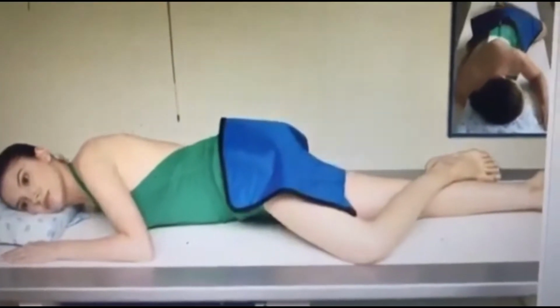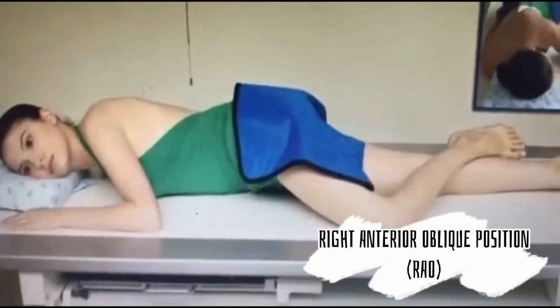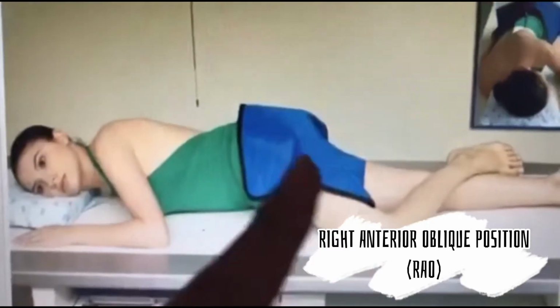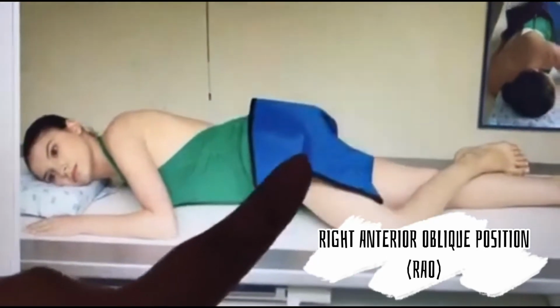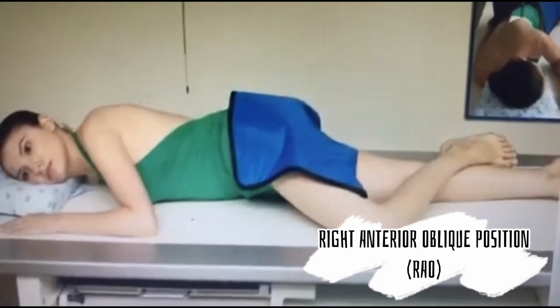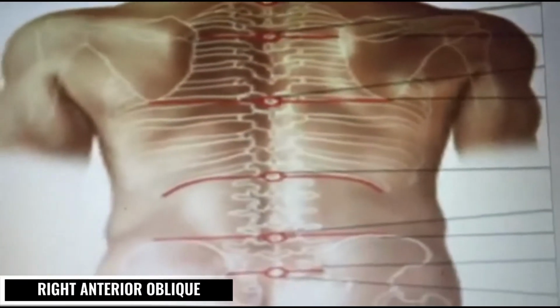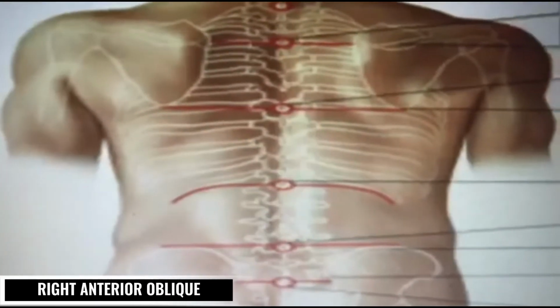Here, what I'm showing you is the patient in RAO position, or right anterior oblique position, for the upper GI series. As you can notice, there is a lead impregnated apron shielding her reproductive organ, because the reproductive organ is highly sensitive to radiation exposure. Today I'm going to discuss the CR, or central ray, of the RAO position.